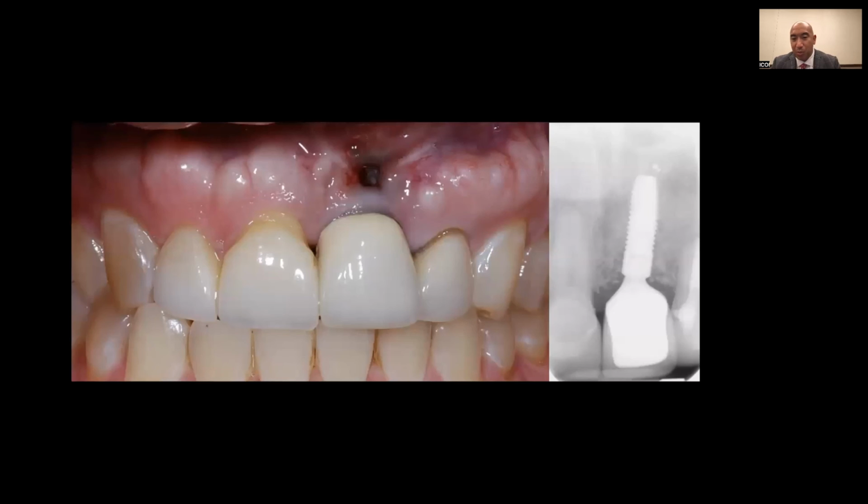So what do we do when we have just a complete failed implant site? Like it just didn't work and we've got to start over. Well, one thing I can tell you about myself, I don't like to twist implants out when they have 4 walls of bone around them. I don't like to cut them out. I hate removing implants unless they're just grossly misplaced.